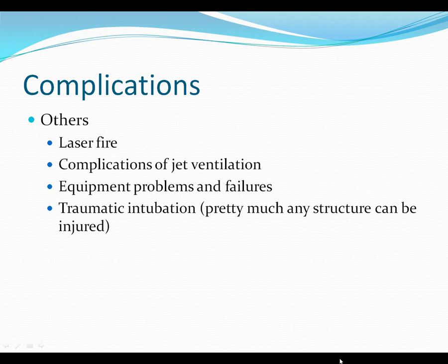So you can have anything from rare things like a unidirectional valve failure to circuit disconnect, which, if it hasn't happened, I'm sure it will happen at some point. To the ventilator not working right, or somebody didn't seal the absorbent in properly so it leaks. You name it, it could happen.